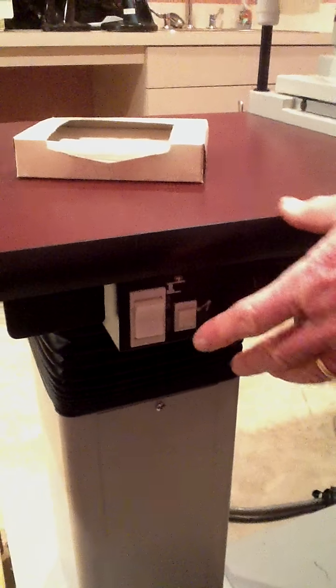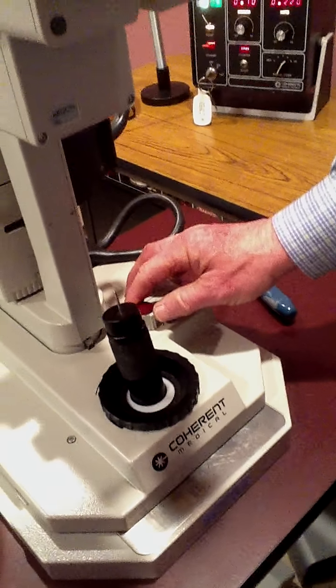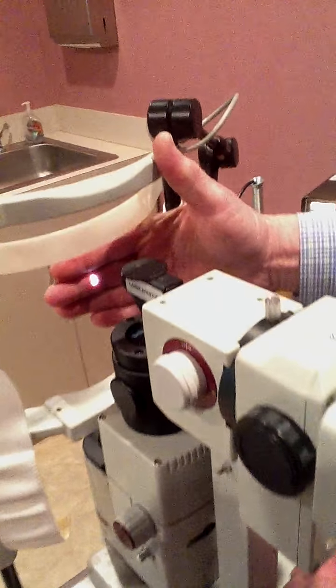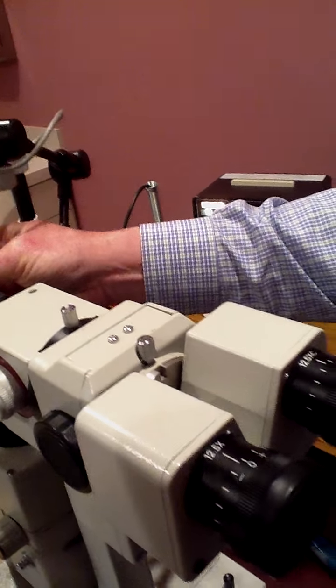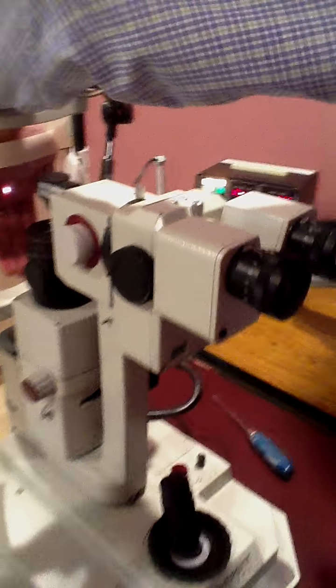Now we'll go to the console and you have to switch a few buttons on. Switch that up and that. This knob here controls the on-off for the light. You can see the various intensity of the light by turning this. And there is the aiming beam, which is the intensity regulated with this.